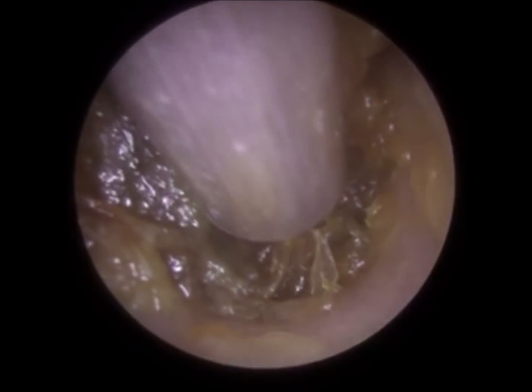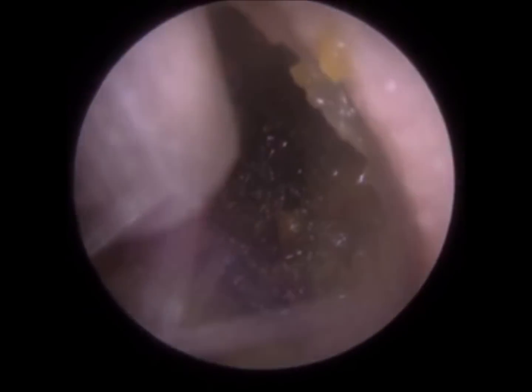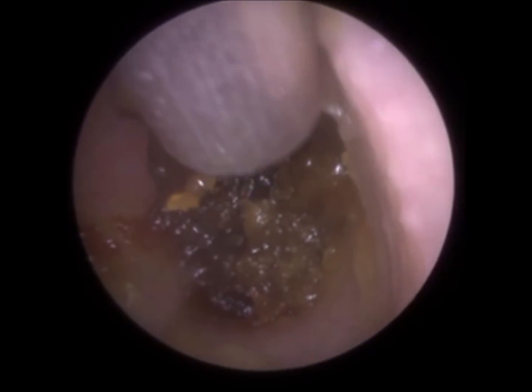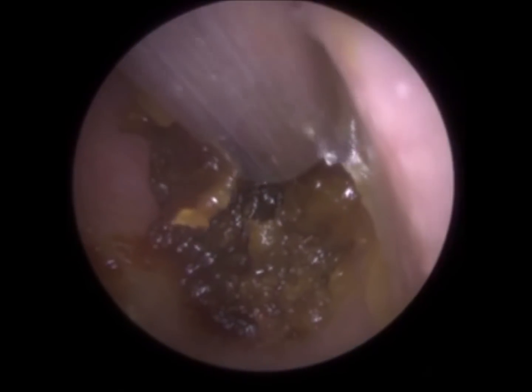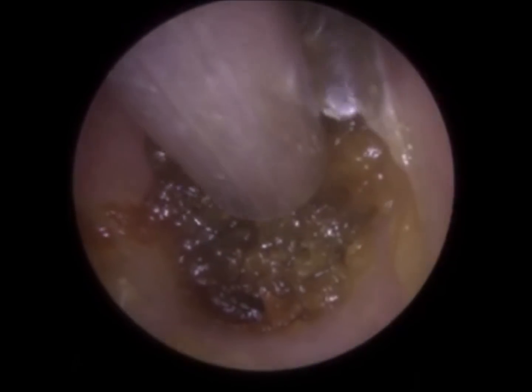So I just had to be very cautious when I was doing this procedure. I just didn't want the patient to make any sudden head movement. So when I'm inside the ear with the instrument, and obviously this wax is quite deep, it is impacted, I've got one eye on the patient, in essence, just keep an eye on them, and I'm constantly at the ready to remove the suction probe if need be. So it's a very tentative procedure.